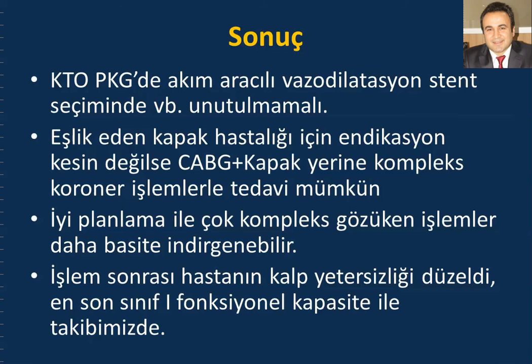At the beginning there were two CTO lesions and one calcific LAD lesion. It was the only open artery, but we did not perform circumflex CTO because there was no viable tissue in the circumflex territory, and the lesion became less complex in this case: one CTO and one calcific LAD lesion.